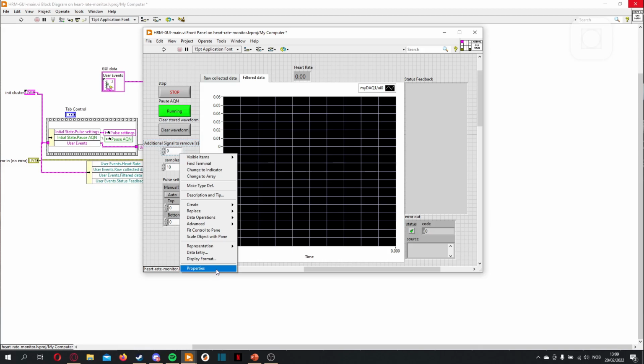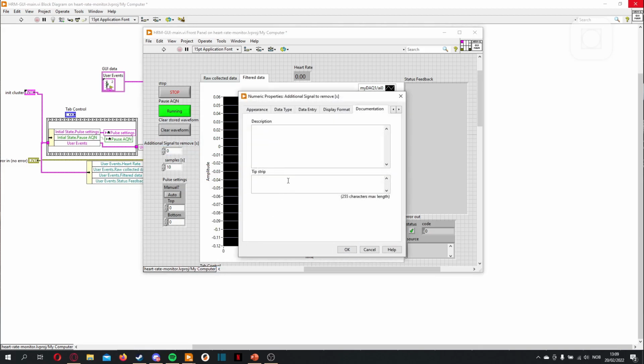Then this one. So this one is a bit more complicated. If you remember from previous lessons, we added this one because sometimes a filter adds an artifact to the signal and we want to remove this. So we could have a longer explanation here and then a short one here, but I think I can manage everything within 255 characters. So yeah, I can just write what I said. Sometimes the filter leaves unwanted artifacts in the signal. This control allows us to remove them.